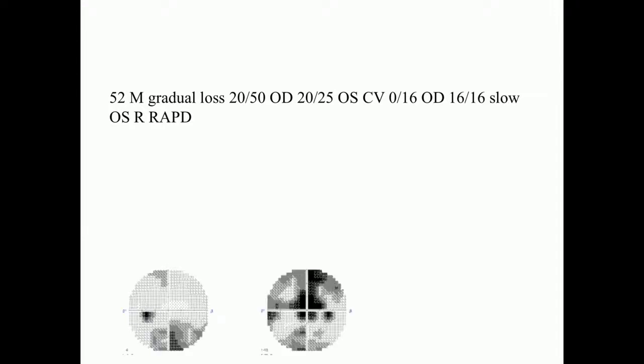So right off the bat, this seems a bit odd for glaucoma. But, you know, if it's an end-stage glaucoma, it could be. The left asymptomatic eye looks like this. There's this inferior loss. And the right eye shows the superior and inferior losses peripherally, but there is a smack right in the middle of a cecocentral scotoma. This is very atypical of glaucoma. So the first thing we want to rule out here is a compressive etiology.